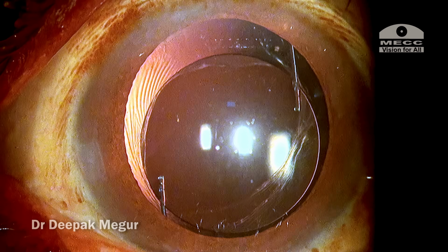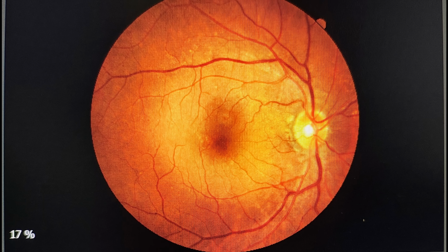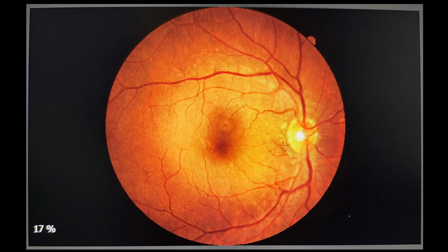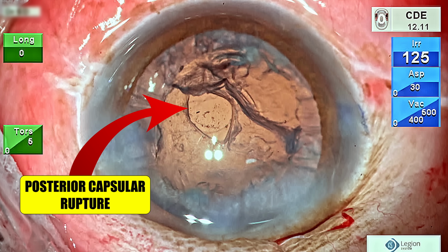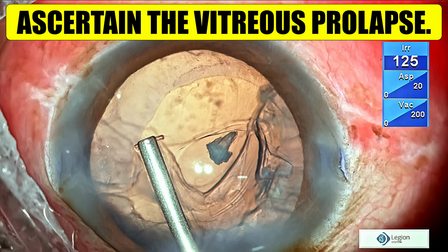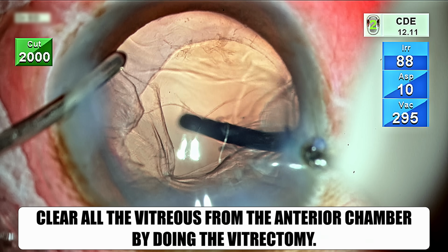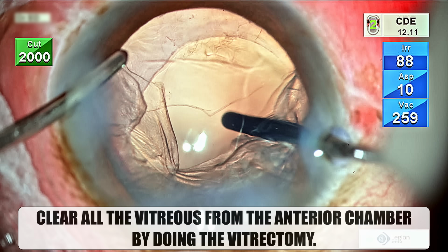After maybe 2 weeks, 1 month and 6 weeks, we're going to evaluate the peripheral retina for any retinal break, and also the OCT macula needs to be done to rule out any CME. To summarize, a few key points. When we have a posterior capsular tear and question mark vitreous prolapse, first ascertain vitreous prolapse. If there is vitreous prolapse, always proceed with the anterior vitrectomy first before thinking of removing any other cortex.